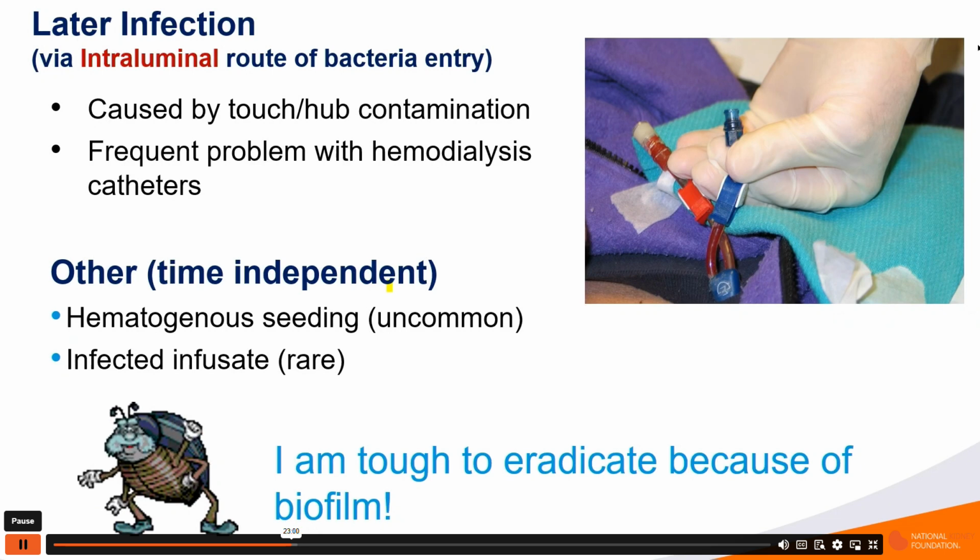And I have actually seen in our unit a cap that has fallen. The nurse looks at it and says, "Is anyone looking?" Case of the 7-second rule, and puts it on. And I just say, it is not a cookie. You cannot do that, right? So no, you cannot do that at all.